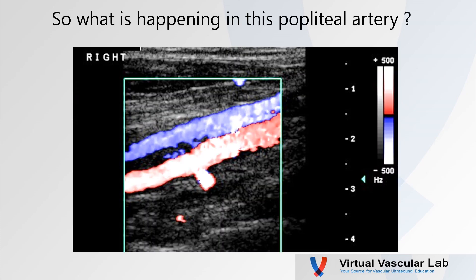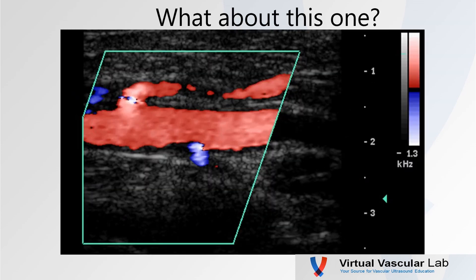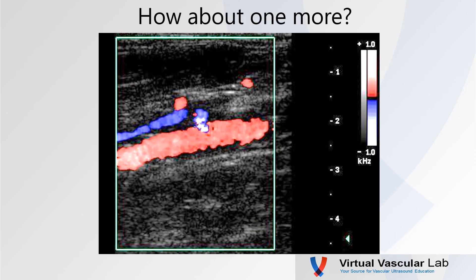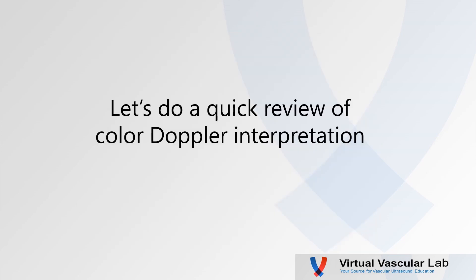Here's a color Doppler image of a popliteal artery. I'll give you a minute to look at that. What do you think? Here's another popliteal artery — what do you think about this one? How about one more? Take a minute and look this one over. Before we go back and revisit these, let's do a quick review of color Doppler interpretation.